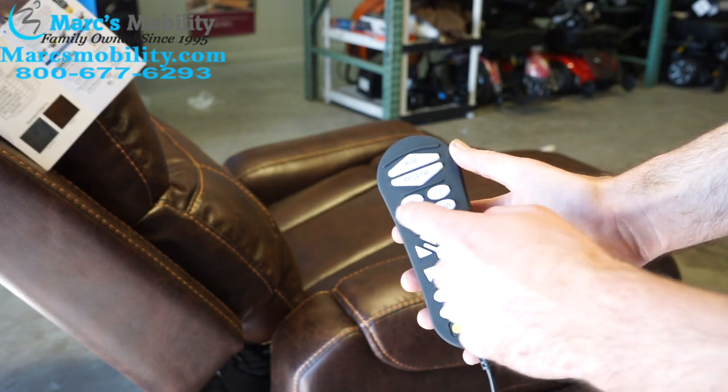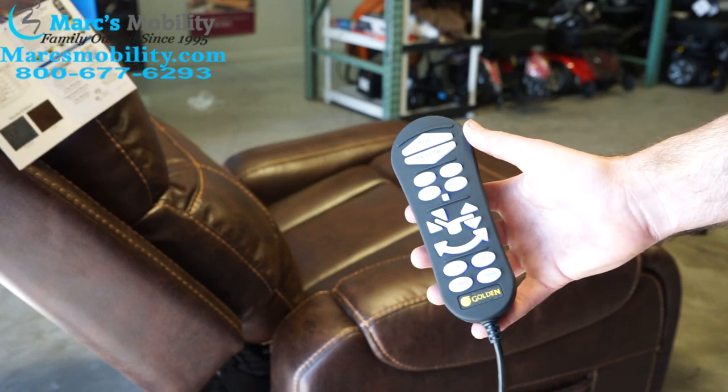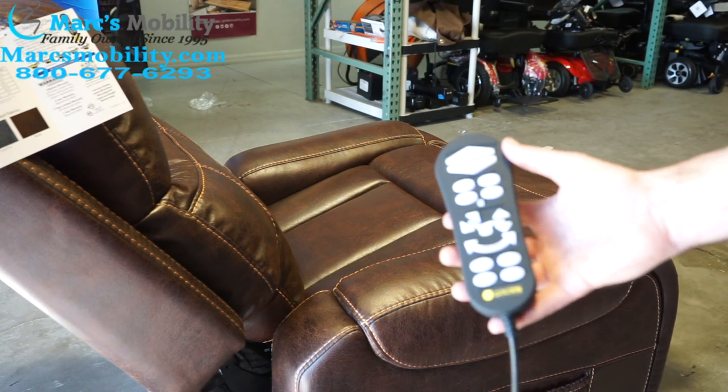That was just the TV button. You can set your own personal zero gravity, sit, TV, or rejuvenation functions — all the same way, by holding the M button and setting whichever position you want. That is how to program a manual function in Golden lift chairs.